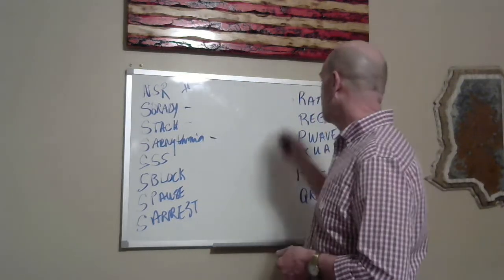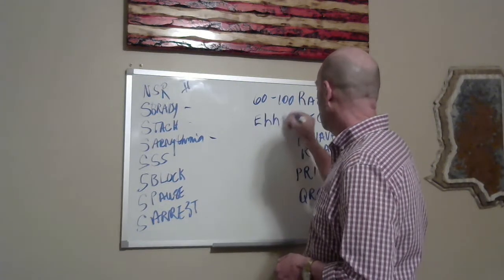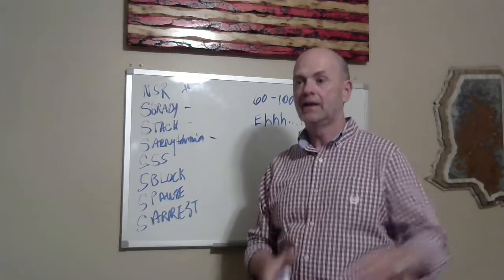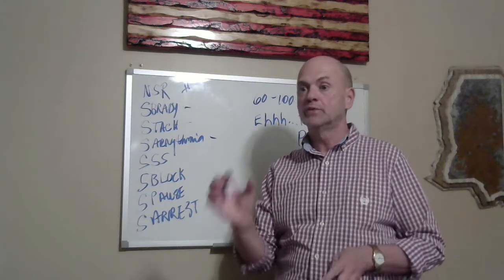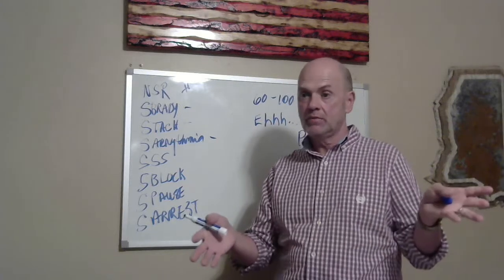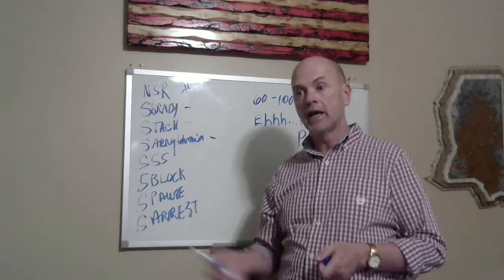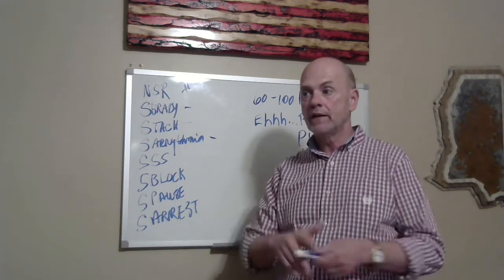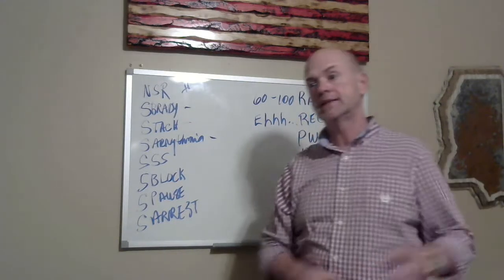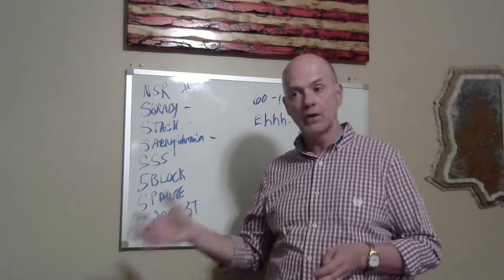Sinus arrhythmia. What's the rate? 60 to 100. Is it regular? Yes, it's regular. If you look at it, you're going to see some slight variations from R wave to R wave. Slight variations. You can see them, but they're not gross. The rate should not be changing from 60 to 90. If we're looking at the monitor, you may see a rate that's in the 70s, 71, 72, but then the monitor's toggling back to 69 to 73. There's not giant changes from R wave to R wave, but they are not absolutely regular.